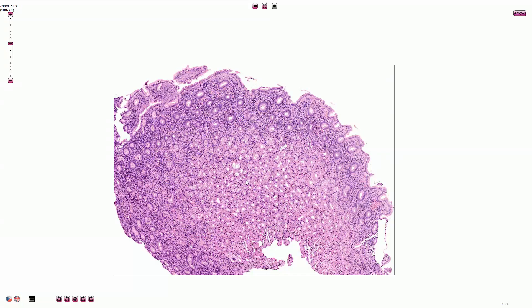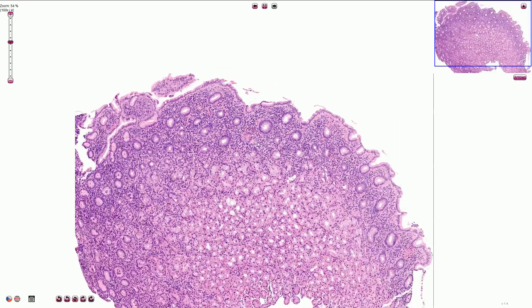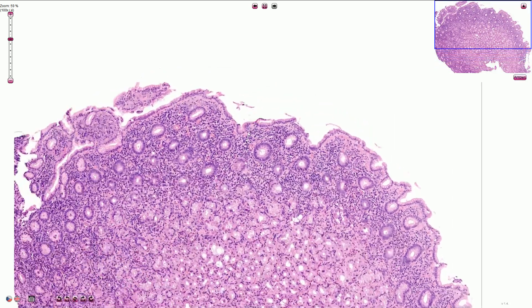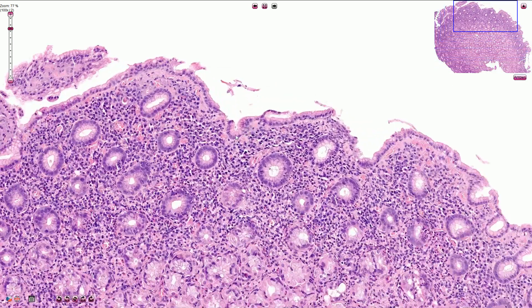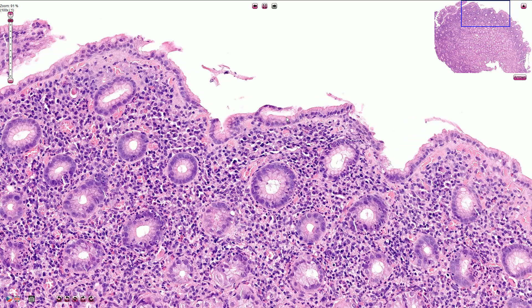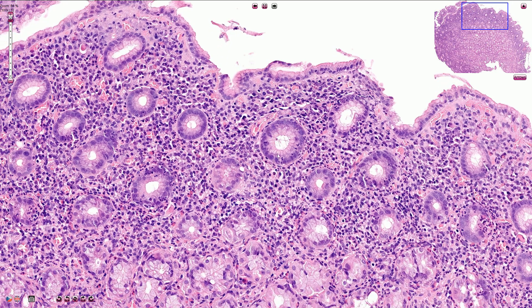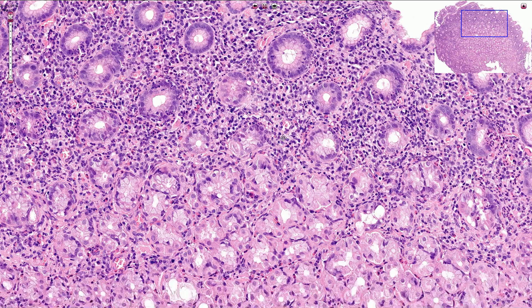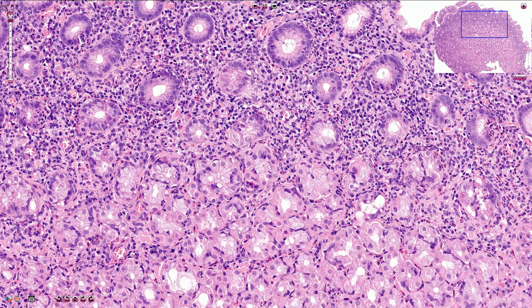Here we have the superficial biopsy of the gastric mucosa. The surface is lined by columnar type of epithelium with basally located nuclei and neutral mucin content in the apical cytoplasm. In the superficial portion we see gastric foveoli, and deeper we have the gastric glands.